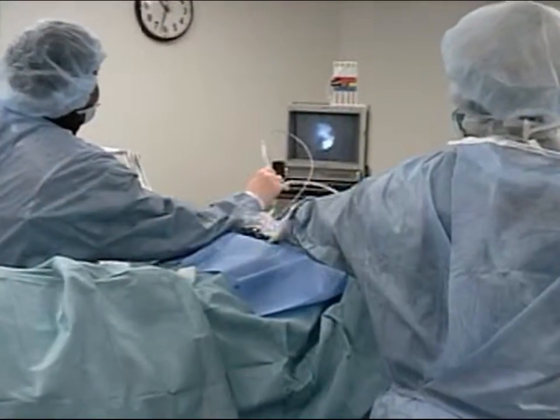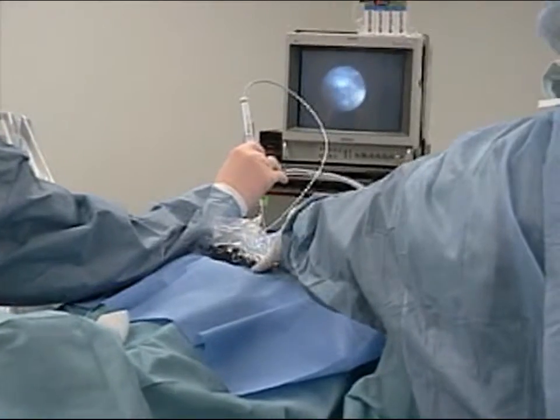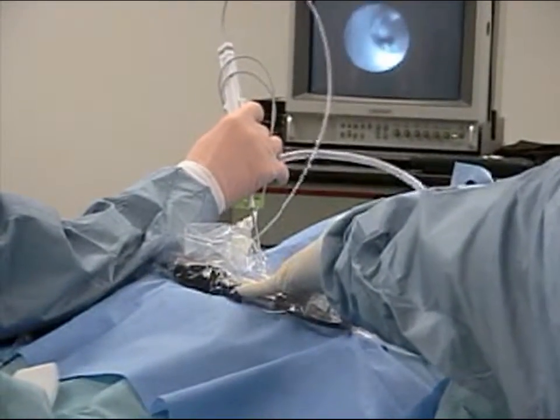LASE endoscopic discectomy is a procedure for treating contained lumbar discs. It is not indicated for free fragments, extrusions, or for patients with significant bony compression.